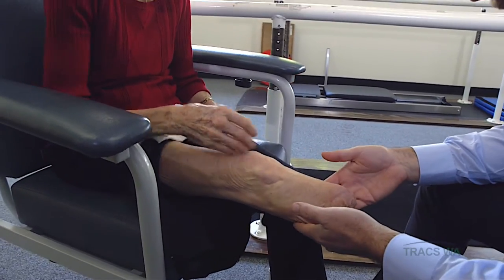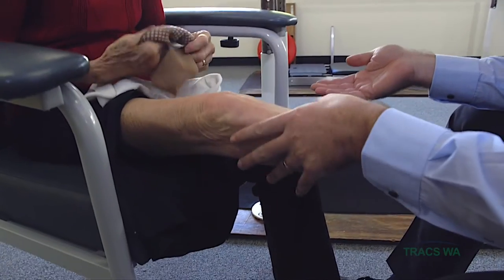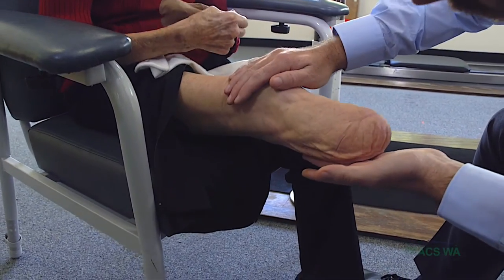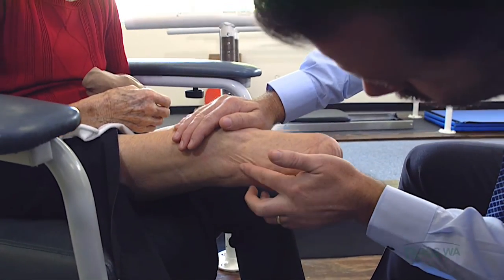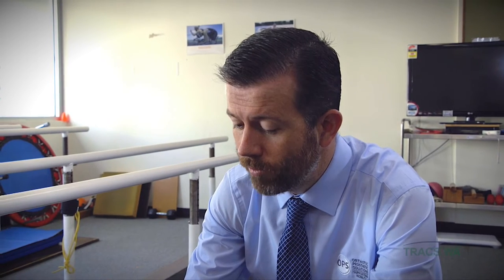Your stump is looking a lot better there — it's all healed and ready to go. It's really important, though, Val, to keep an eye on your skin, because we're taking the weight through your skin, and it's really important that you get very good at monitoring that skin to make sure there are no problems.